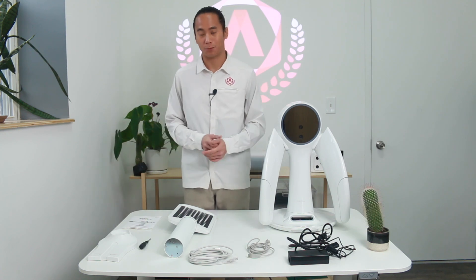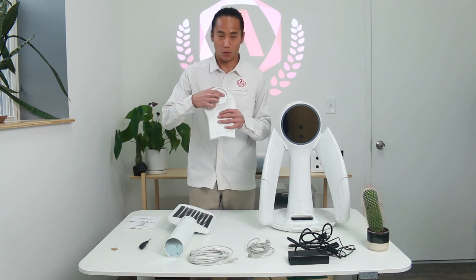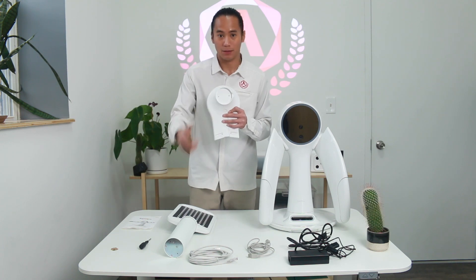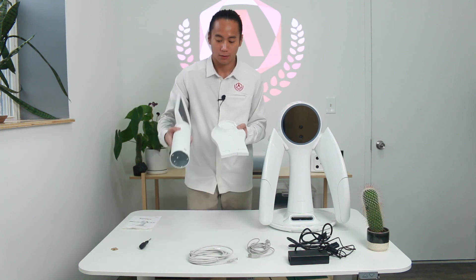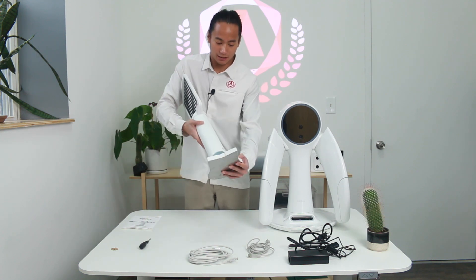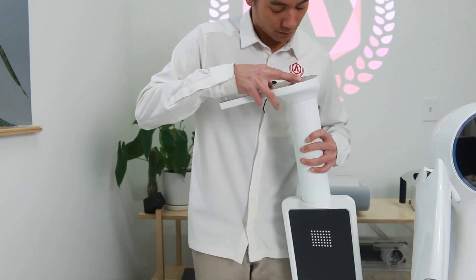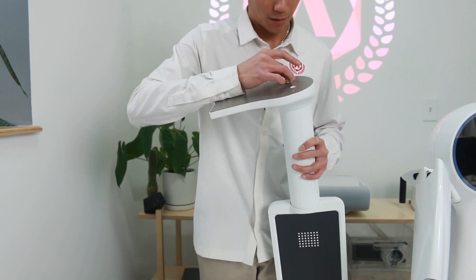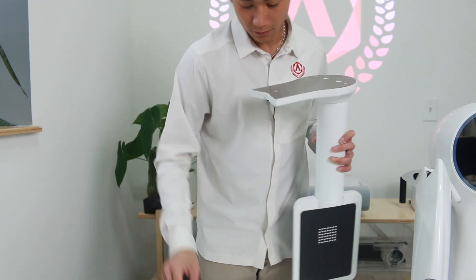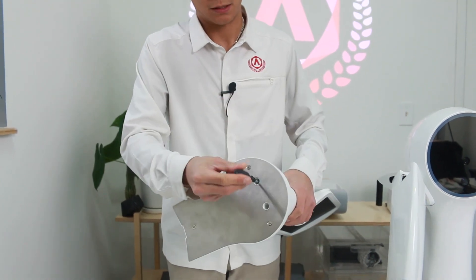The first thing we're going to do once everything is unboxed is assemble the calibration plate. In the stand, you're going to notice there's one small slot for the tab in the calibration plate. Align the base with that tab, then take the screws, drop them in, and fasten them up with the driver.